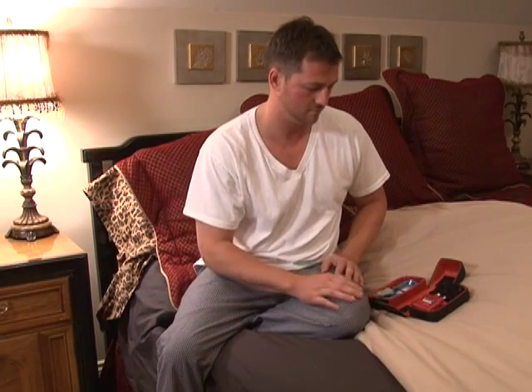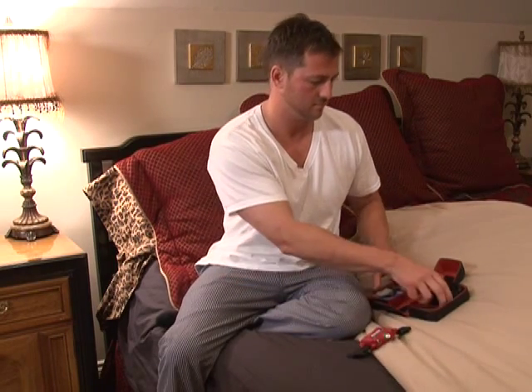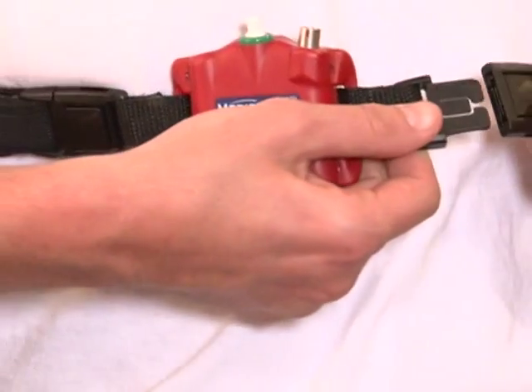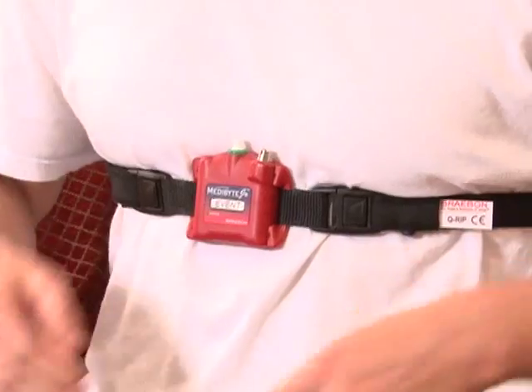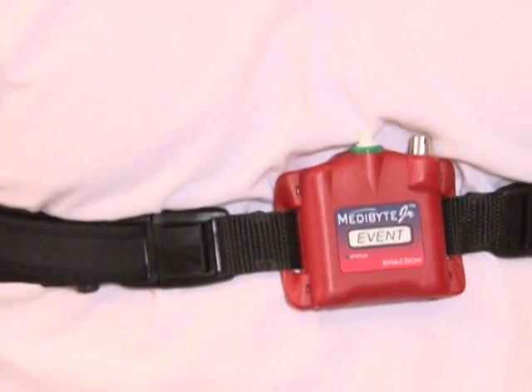First, open the case and remove the adjustable effort belt and Metabyte unit from the case. Connect one side of the effort belt to the unit and wrap the belt around your back and connect it to the other side of the unit, keeping it chest-high with the unit centered on your chest right below your breast.